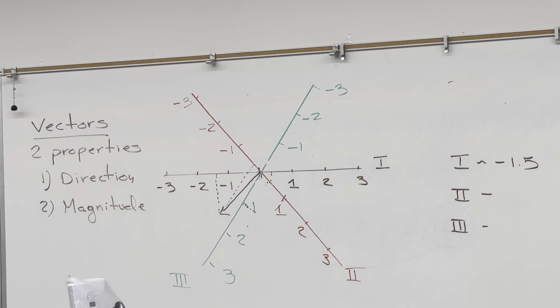And then you're going to record, I would say, 5 complexes from each lead. And then you're instructed to actually make various measurements of the EKG waveforms. I can't put that up here because I'm not sure what's going on with that projector up there. But that's in the instructions for the lab.